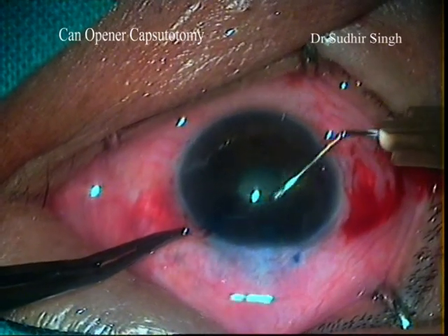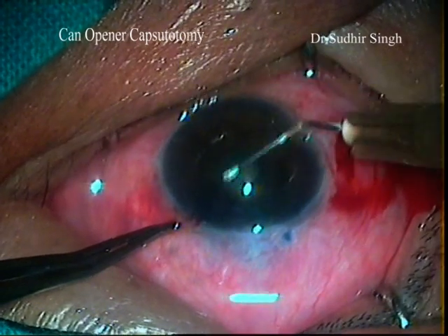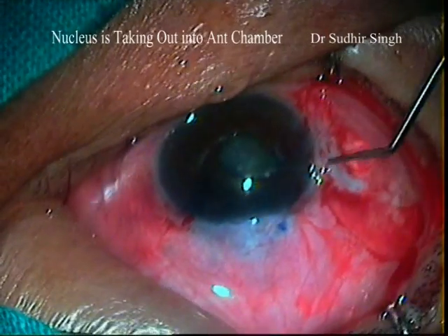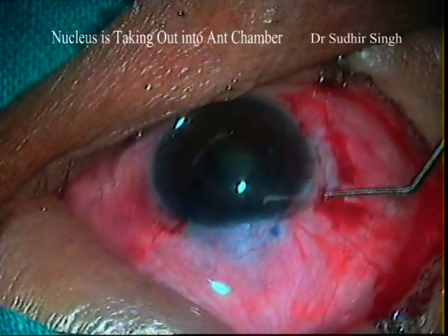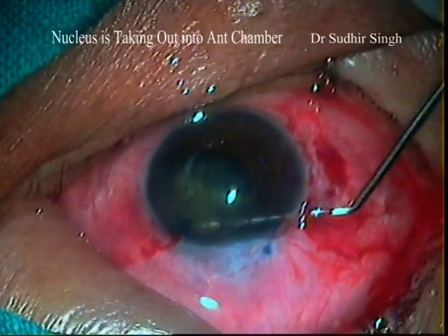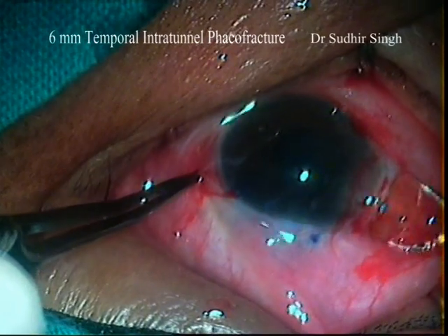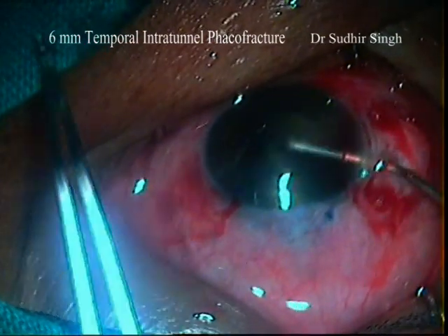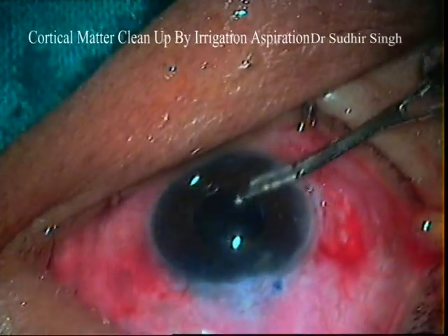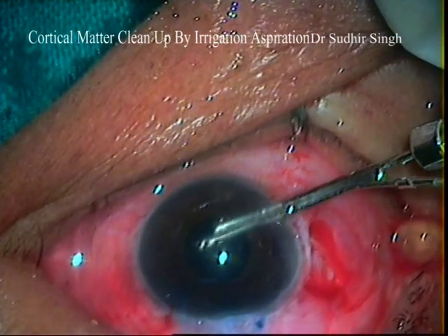This is a post-trabeculectomy complicated cataract. The pupil size is about two millimeters. This is also a rigid pupil. The lens capsule is stained with trypan blue, and multiple puncture can opener capsulotomy is done. After hydrodissection, the nucleus is rotated and taken out into the anterior chamber by Sinskey hook. Nucleus is managed by six millimeters temporal intratunnel phaco fracture manual small incision cataract surgery. Cortical matter is cleaned by irrigation-aspiration cannula carefully, and a PMMA IOL is implanted.